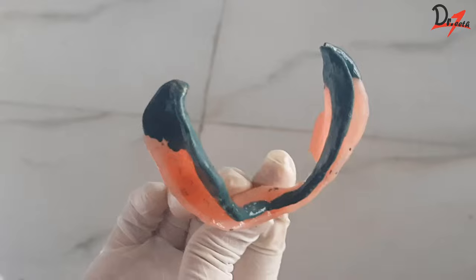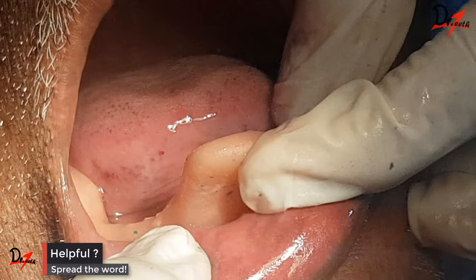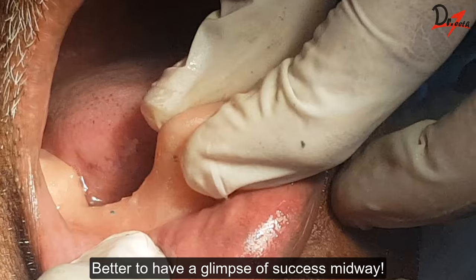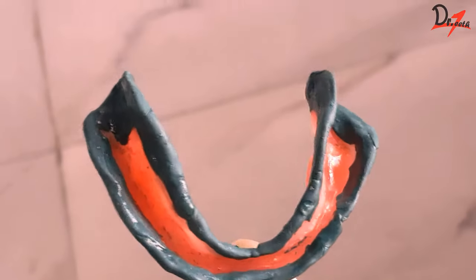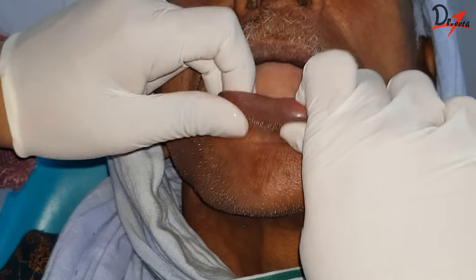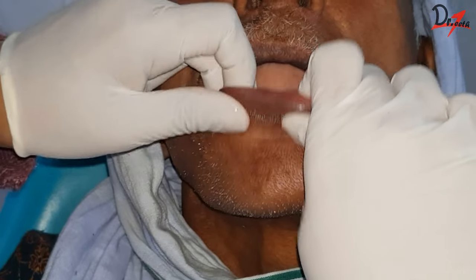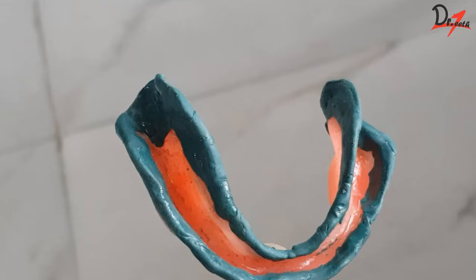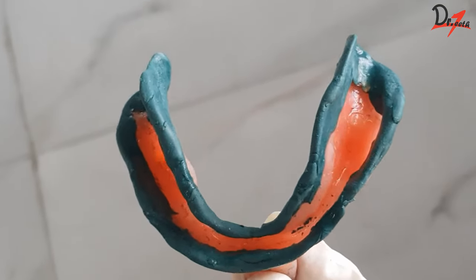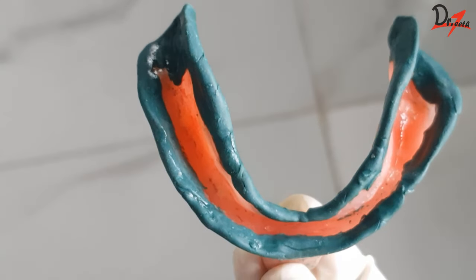We followed this particular sequence because just by recording the lingual flanges throughout we can get the retention — as you can see here, we are getting posterior retention. The last step is recording the labial flange. This is done by lifting the lip outward, upward, and inward. The thickness of the flanges may have to be adjusted — you should not have very thick flanges and also you should not have very thin flanges.